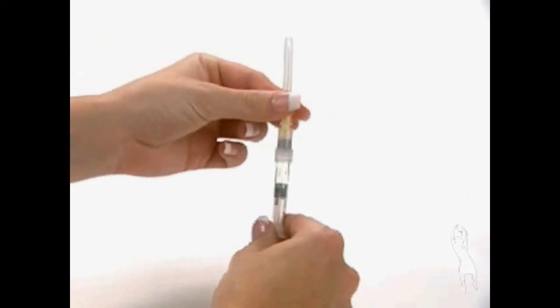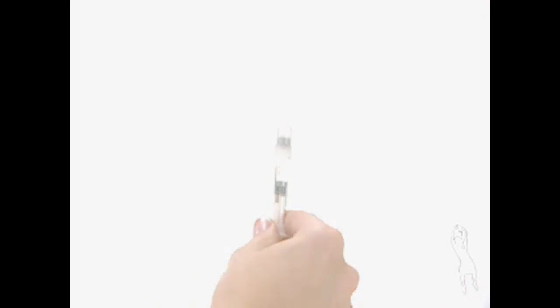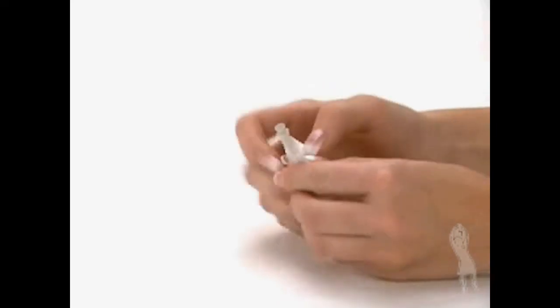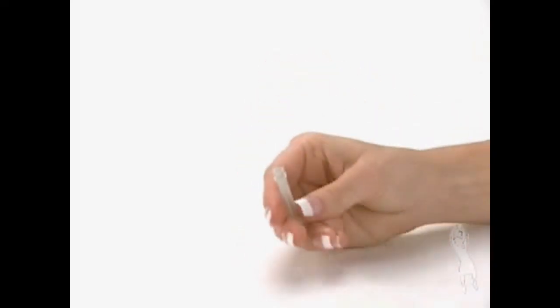Detach the mixing needle from the syringe and lay down the syringe. Remove the wrapping from the gray injection needle. Twist the injection needle onto the syringe and remove the cover of the needle.